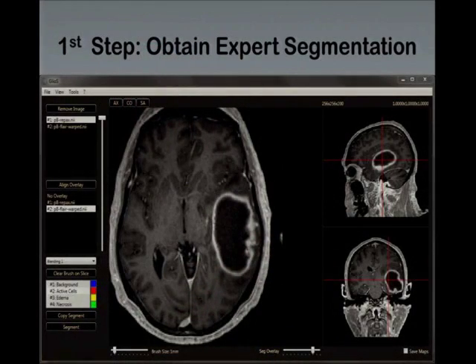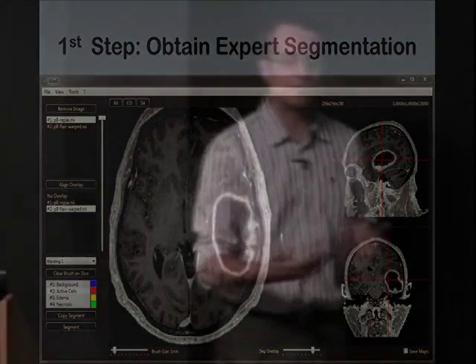So allegedly, this is a simple example because this is all black inside. So you can say, oh, some of you might be familiar with region growing or distance transform sort of techniques. You say, oh, anything will work on this. And you're right, this is a particularly simple example, but it works. This technique works also when applied to more tricky sorts of tumors where the necrotic core, for instance, is very highly variable and highly textured.